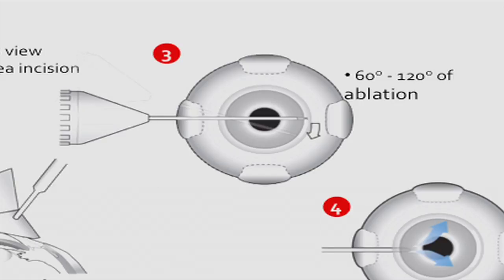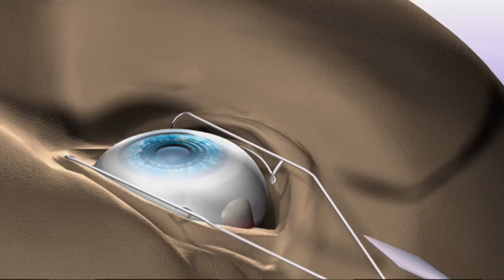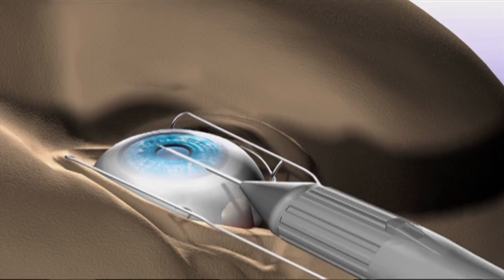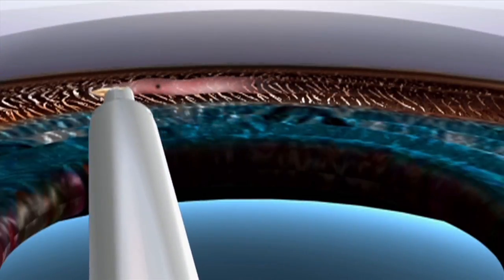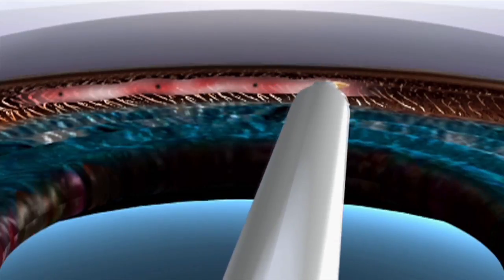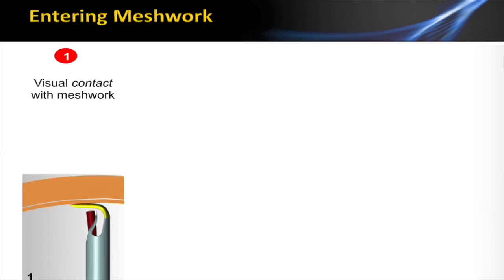Step three: you're going to ablate and then irrigate and aspirate. It's rare that these incisions need suturing. When you first start doing this surgery, I'd definitely recommend making a standard clear corneal tunnel incision with the 1.8. Remember: the longer your tunnel is, the more watertight it'll be, the less reflux and leaking you're going to get out of the incision. Once you get more experienced, we'll talk about flaring the inner lip. So you'll come across to the left, turn it around, enter where you already started, and then come around to the right.